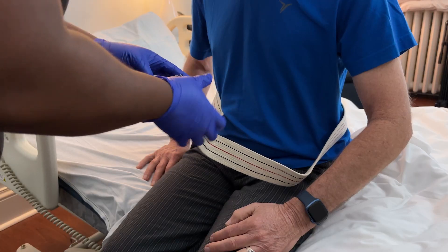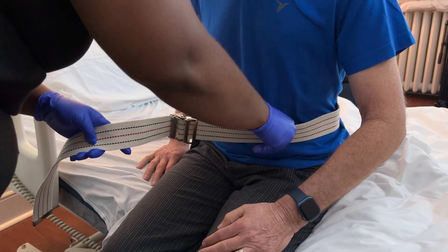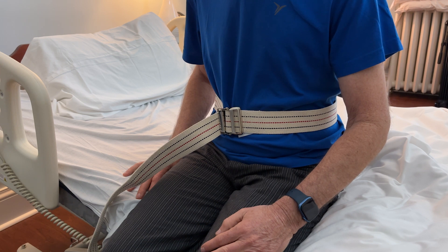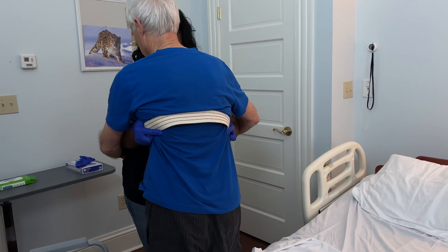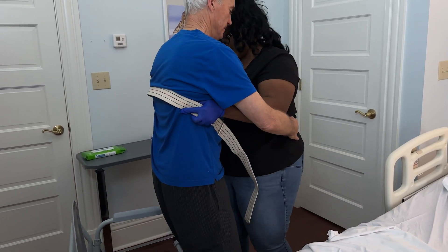Next, place the gait belt around the patient's waist securely. This will provide you with a firm grip during the transfer. Make sure your loved one is sitting on the edge of the bed with their feet flat on the ground. The pivot technique involves turning your loved one's body as a unit while maintaining their balance and support. Review the process with your loved one prior to transferring.